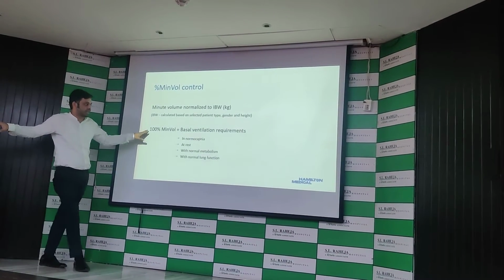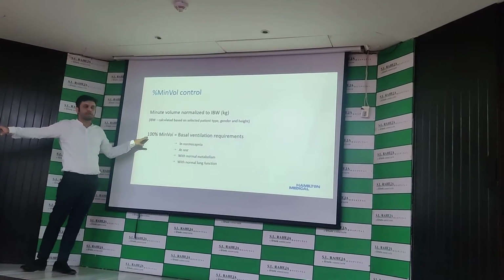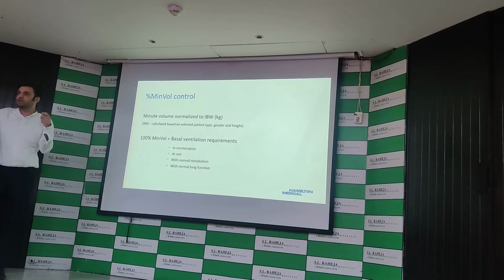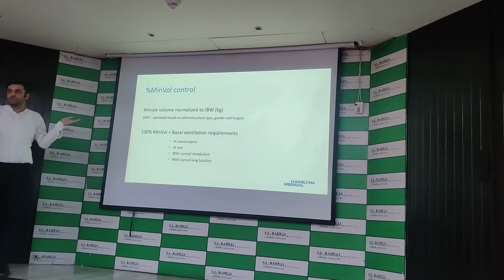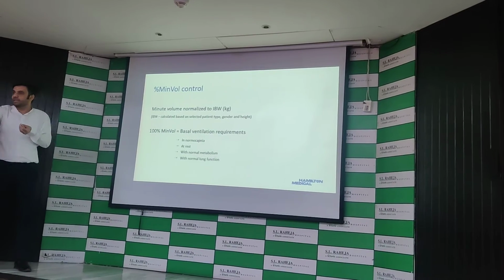Similarly, at rest we can set 100%. With normal metabolism we can set 100%, and even with normal lung function we can set 100%. It is said that even if the patient has fever, or say small metabolic disorders, we still have to set it around 10 to 20% higher than 100%. So suppose we have a patient with fever, instead of setting 100%, we can set 110%.